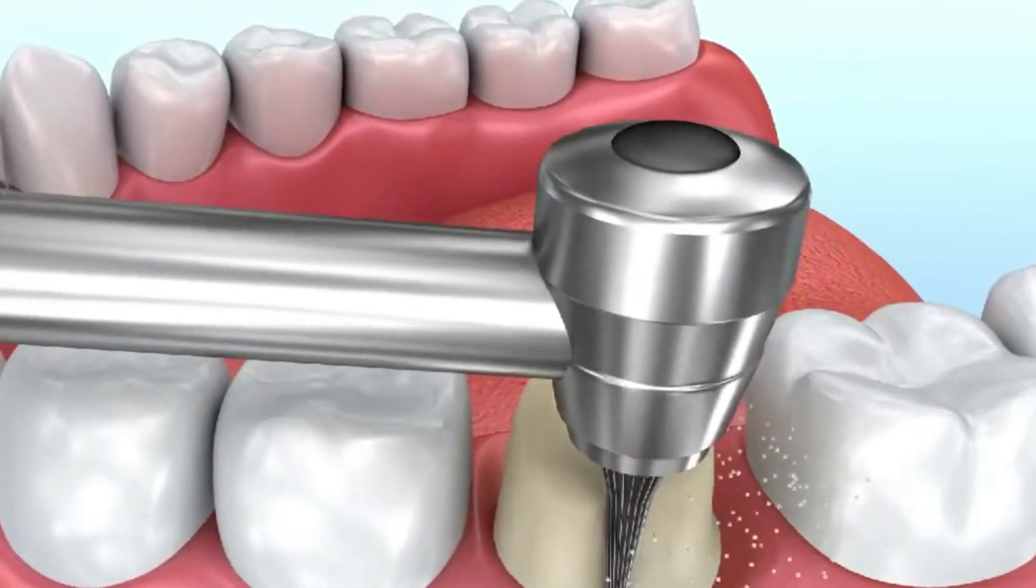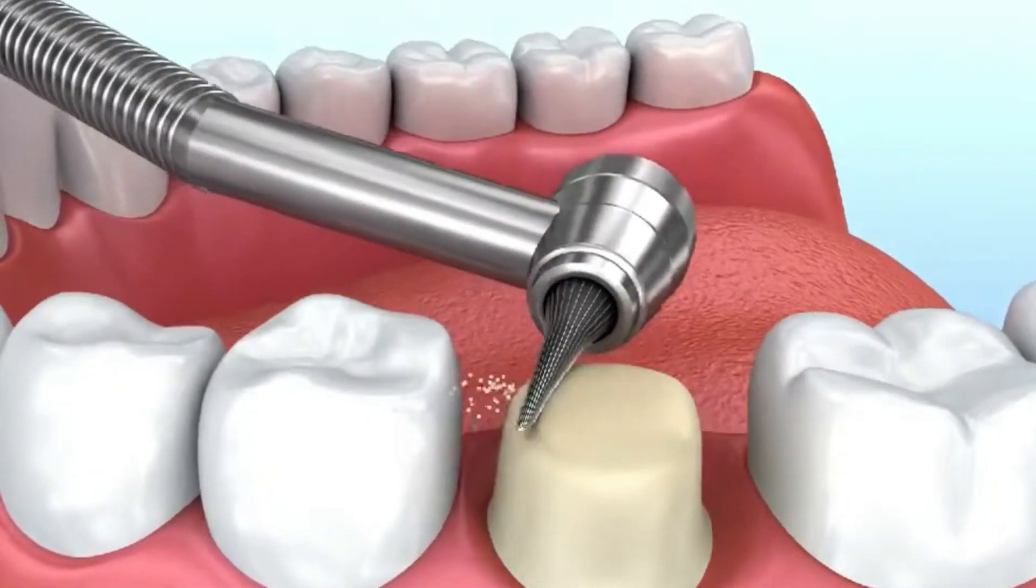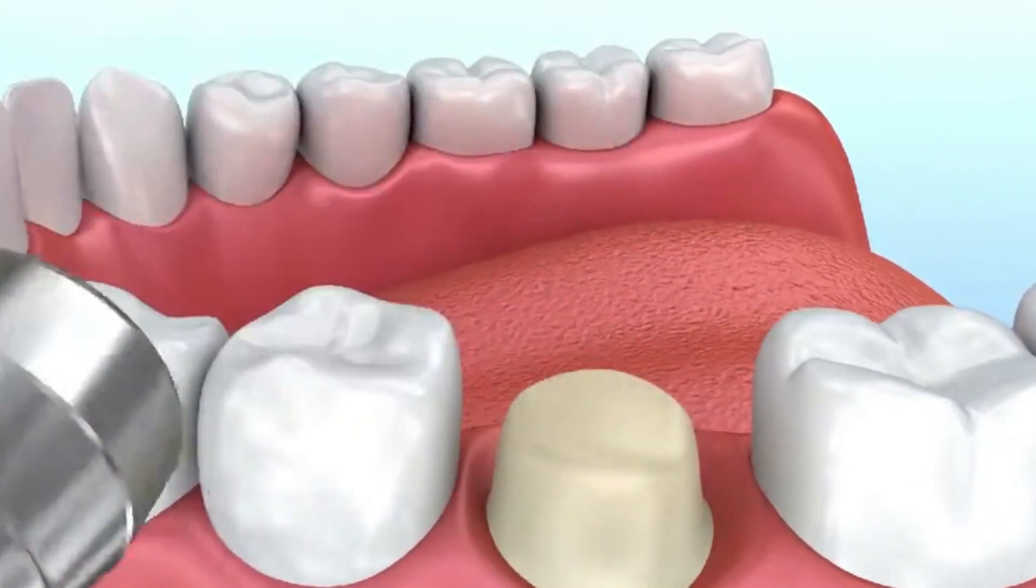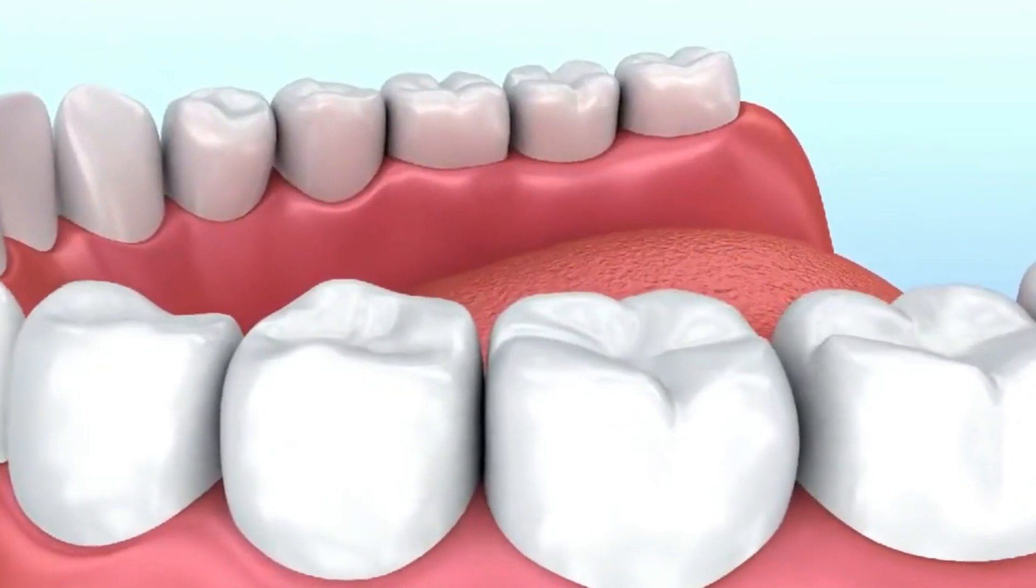The first electric dental drill was patented in 1875 by Dr. Green. And by 1914, electric dental drills could reach speeds of up to 3,000 rpm.